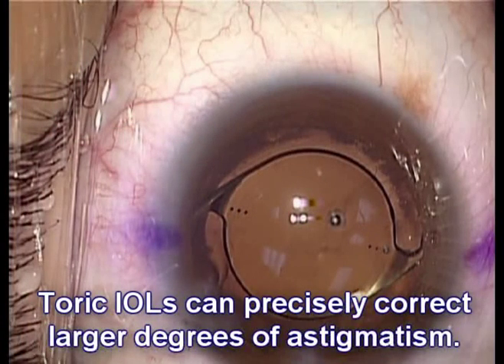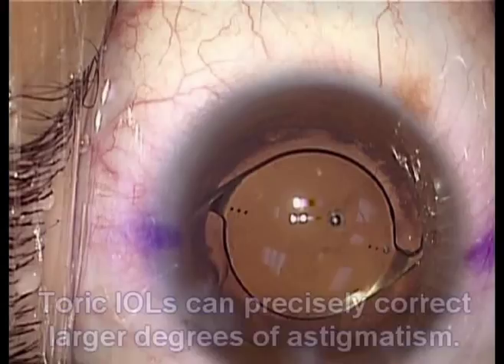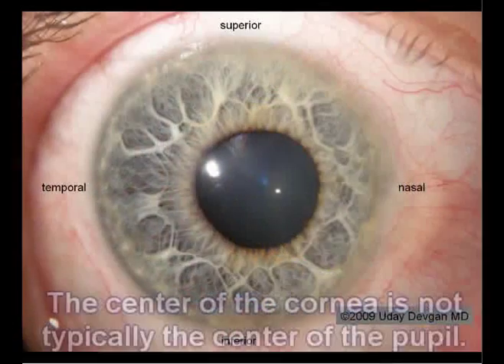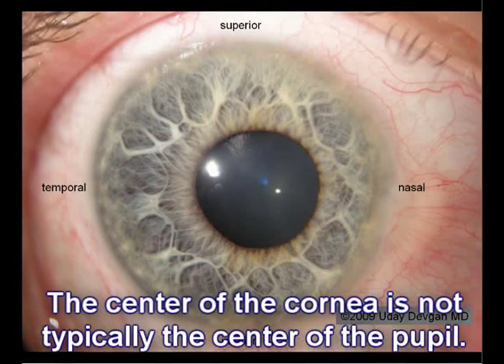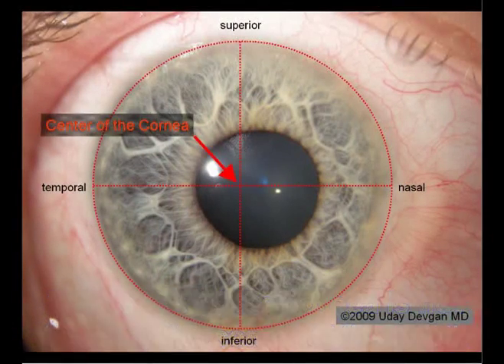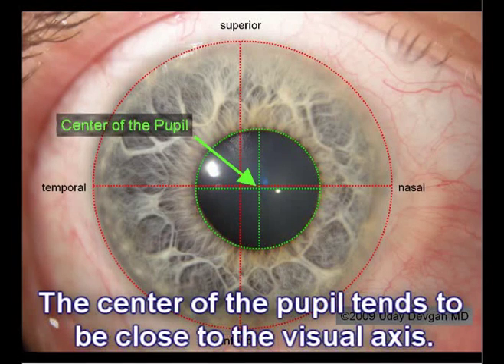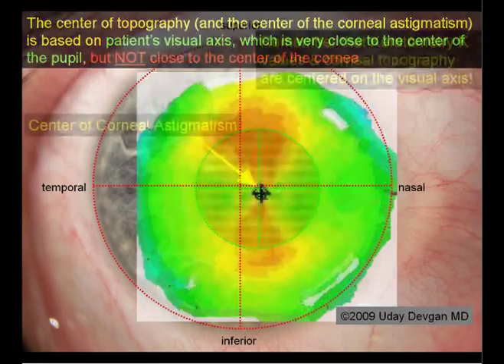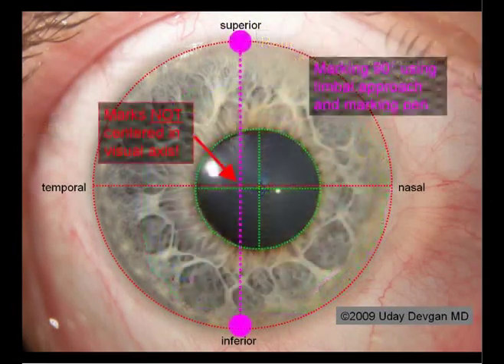Toric IOLs can precisely correct larger degrees of astigmatism. Toric IOLs and other lenses work best when placed in the visual axis. The center of the cornea is not typically the center of the pupil, and the center of the pupil is closer to the visual axis. The topography and the corneal astigmatism is based on the visual axis, which is closer to the center of the pupil. This is not lined up with the center of the cornea.